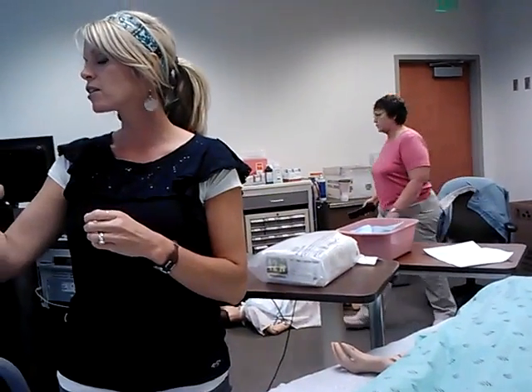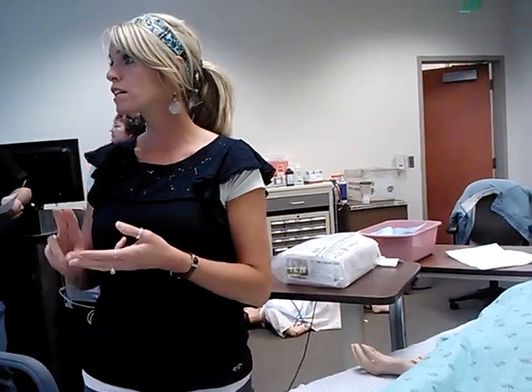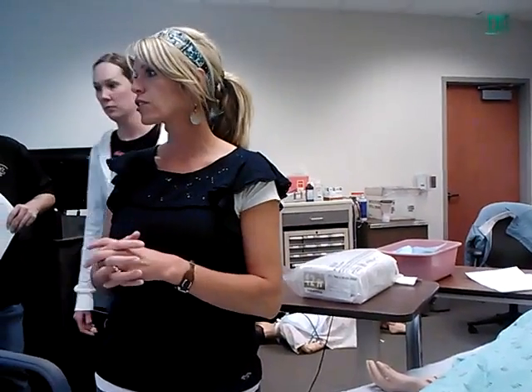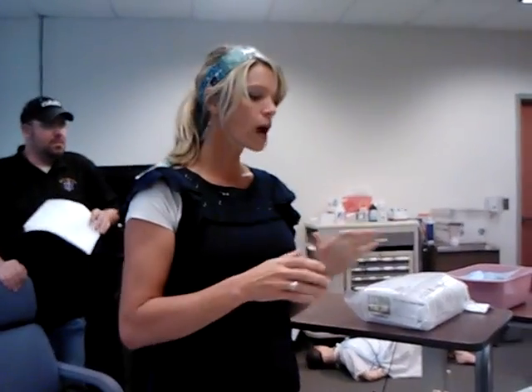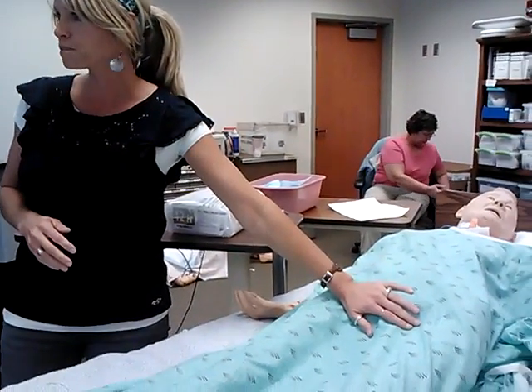In Nephi, or in Ephraim and in Richfield, there should be 2 mannequins with female and 2 mannequins with male. And I need you guys to practice both, because you never know which scenario you're going to get. And you never know in real life. Oh, sorry, I've only passed this off on a female. I can't do you. So I'm going to show you on a female because it's harder than the male.